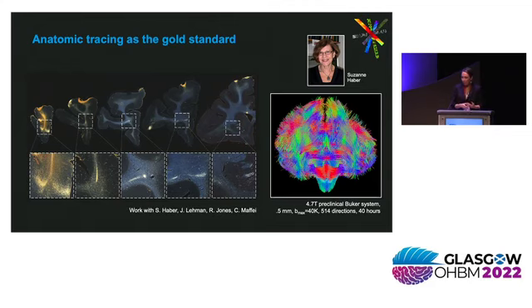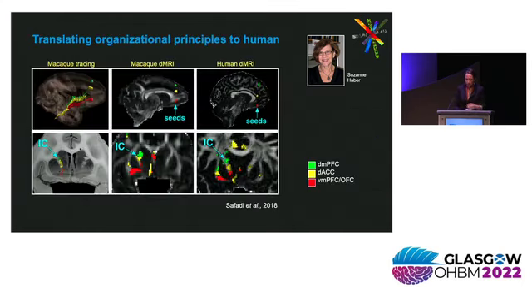We have been collaborating with Suzanne Haber, whose group has been doing these invasive tracer injections for quite a while, to collect high-resolution diffusion MRI scans on some of the brains that have received the tracer injections. We scan these brains ex vivo at the Martino Center, send them back to Suzanne, and then she sections and stains the brains to visualize the tracers. This allows us a point-by-point comparison of tracing and tractography in the same brain.